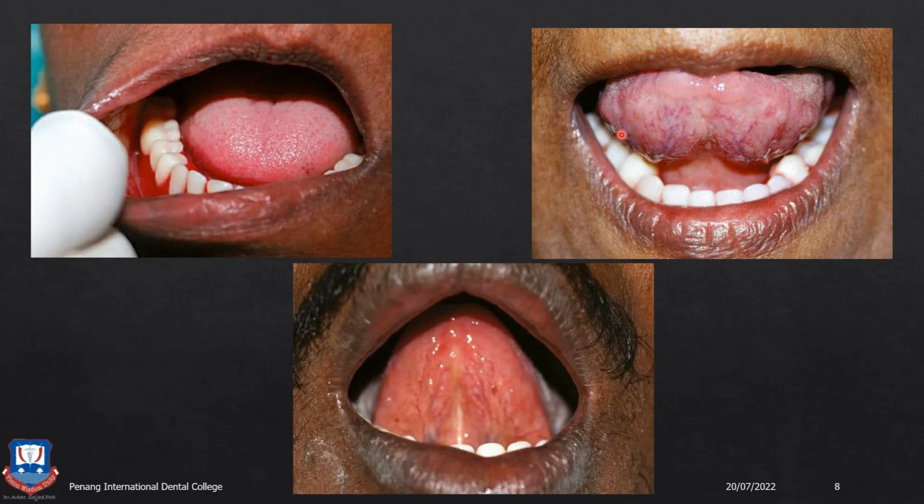Like here you can see the teeth are arranged in such a way that the tongue is large and there is not enough room for the tongue to lie between the mandibular teeth arrangement. This will create instability. Then you also have to check the alveololingual sulcus, whether the denture extensions are such that they do not cause dislodgement or displacement of the denture.